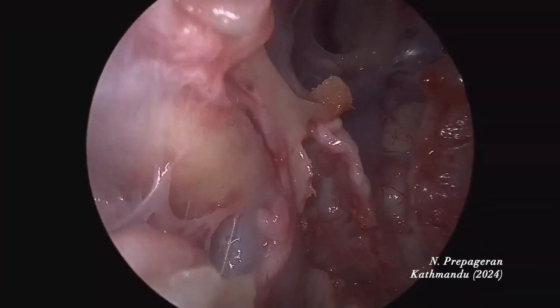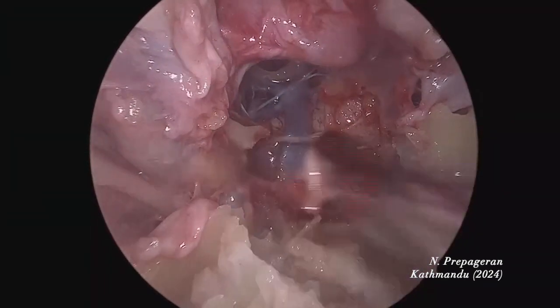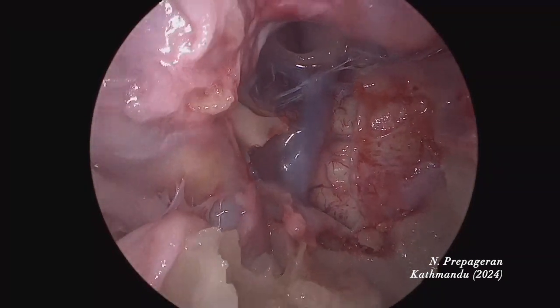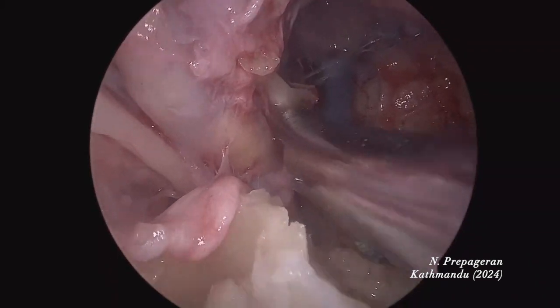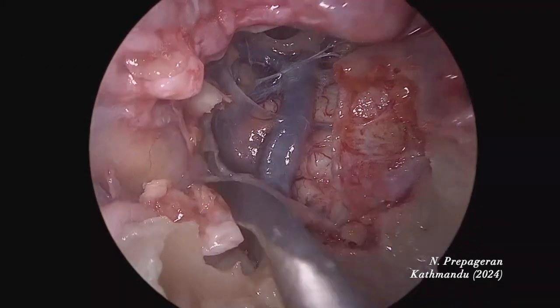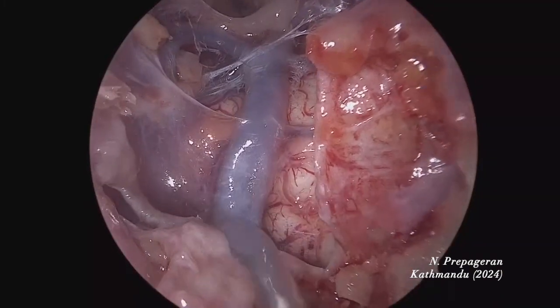Now I'm going to go laterally so we can see more structures. Remember, when you go laterally, be careful because you're coming close to the carotid artery. It's very easy to accidentally damage the sixth nerve because it comes very close to that side as well. I'm removing bone so you can see all the other nerves. It all depends on whether the brain is edematous or not.